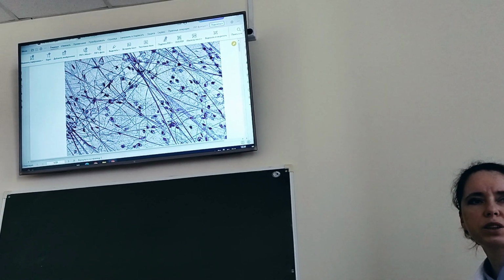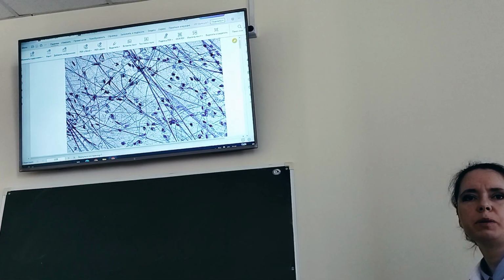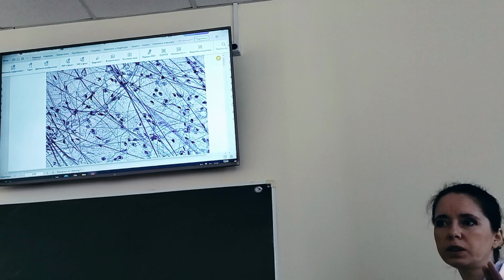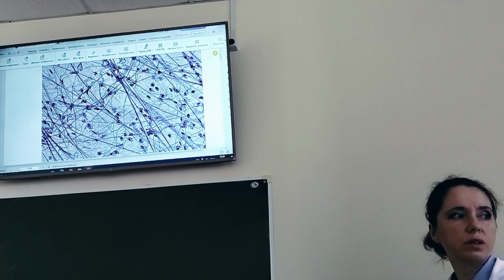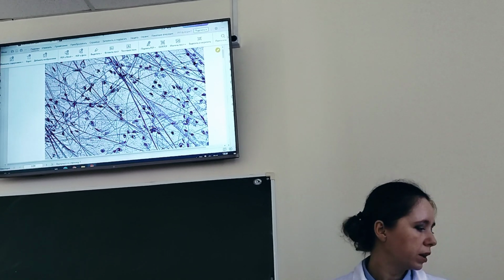In low magnification, you may say some other cells may be present. It is diverse in composition, but the major type of cells are fibroblasts, also cells with irregular shape and irregularly branched cytoplasm. This will be enough for you.